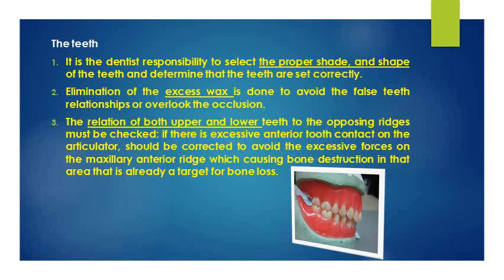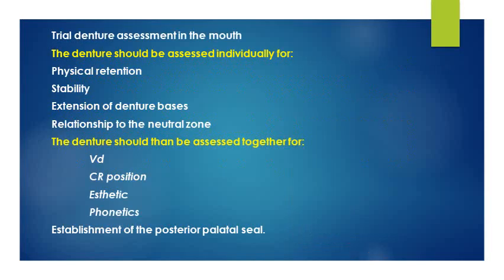The relation of upper and lower teeth to the opposing ridges must be checked in case there is any excessive relation of anterior teeth. It should be relieved in order to distribute the forces over the whole ridge, not concentrated on the anterior ridge, which would cause more resorption.